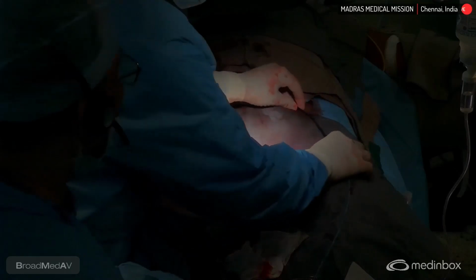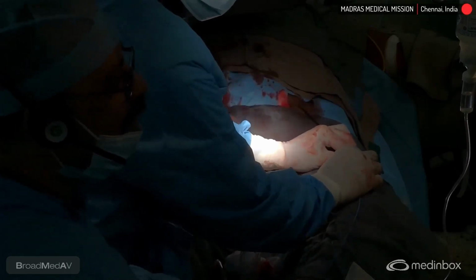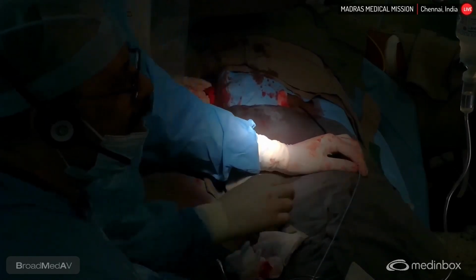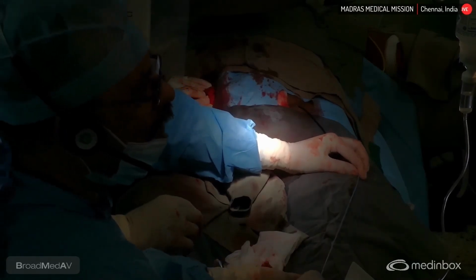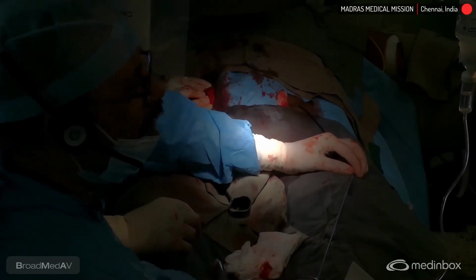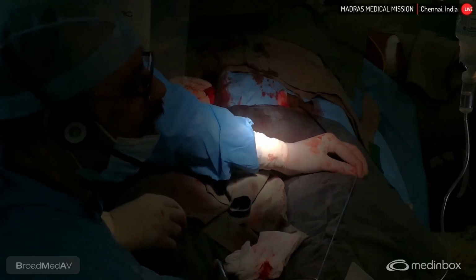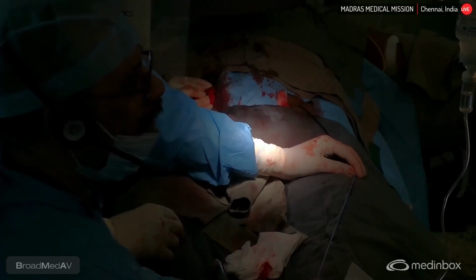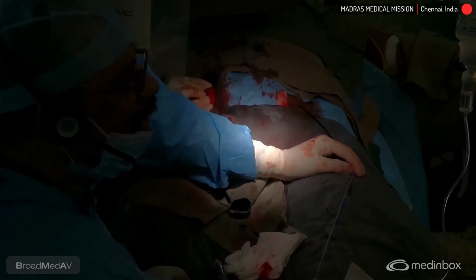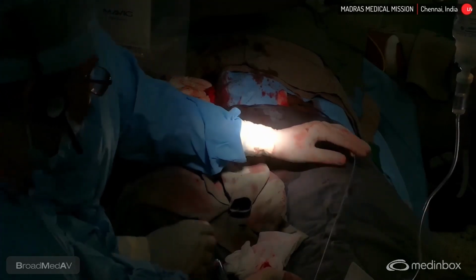Now pull back the sheath down. A little back. Yeah. Or you can take a shot and you can go, sir. This is too low, sir. We have to go up.